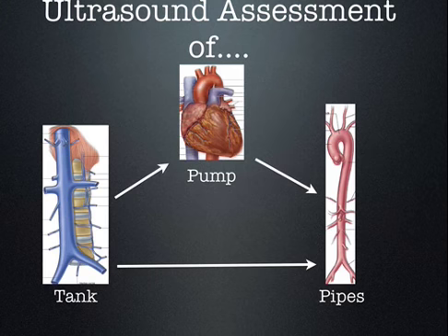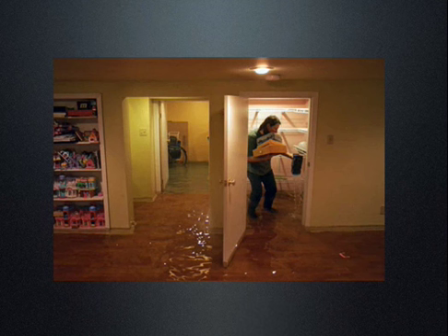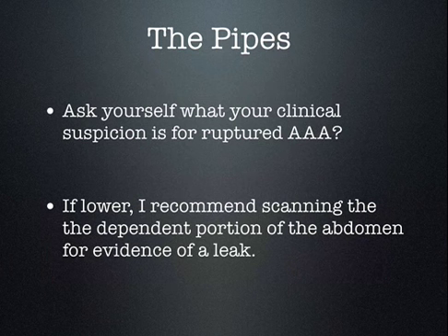All right, moving on from the pump. Let's talk about the pipes. Now, let's look at this right here. We can see clearly there's a leak. Obviously there's a leak. We don't know where it's coming from, and that's kind of what we're using ultrasound to do. All right, you have to ask yourself a couple questions.